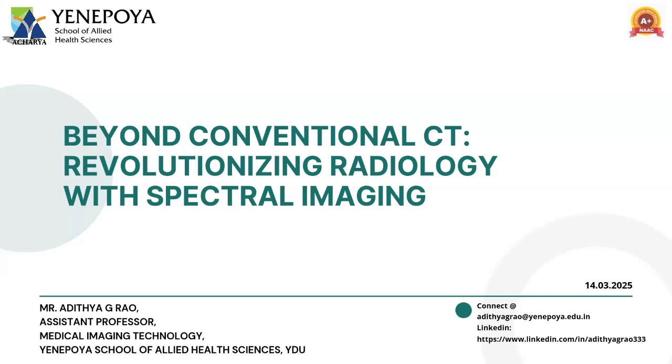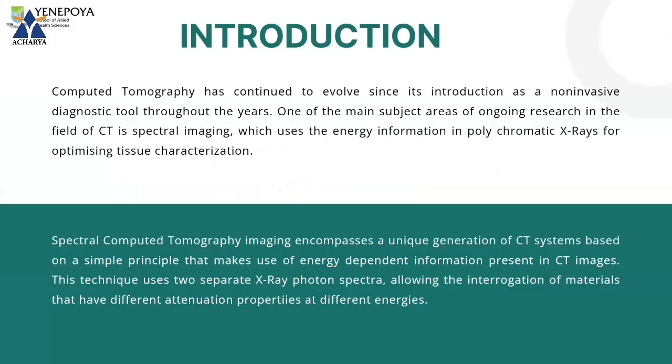Today I just wanted to discuss something which you may have heard about, which is one of the eminent advancements in the field of medical imaging technology. It's something called spectral imaging. The topic for today I've kept as "Beyond Conventional CT: Revolutionizing Radiology with Spectral Imaging." Let's quickly move on to the topic.